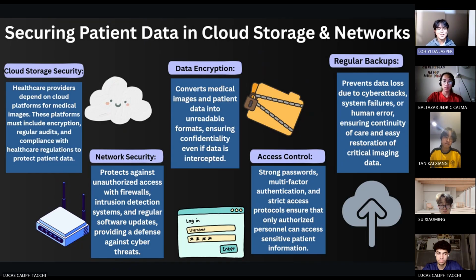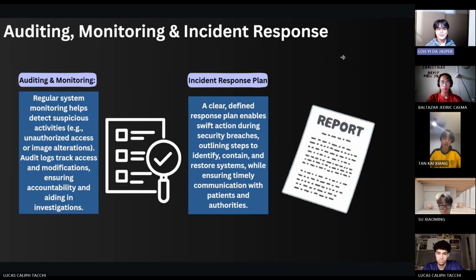In addition, network security measures including firewalls, intrusion detection systems, and regular software updates help protect imaging systems from cyber attacks, system failures, and accidental data loss. Beyond technical safeguards, continuous monitoring also plays an important role in maintaining data security.